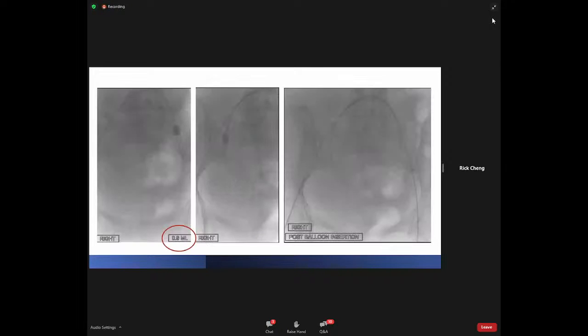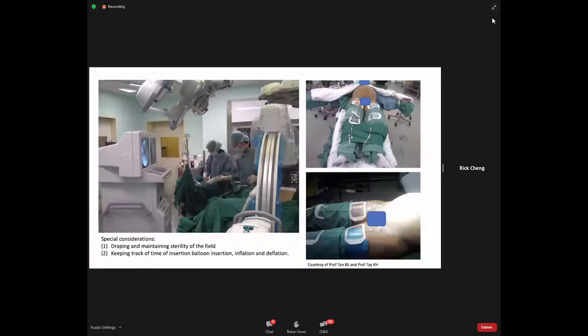Here's a case that's done in the angio suite. You can see the guide wires are left in place along with the balloon-mounted catheters to ensure that there's no dislodgement along with patient movement from the IR suite to the OT. The amount that's used for the balloon inflation is also clearly marked on the angiographic images.